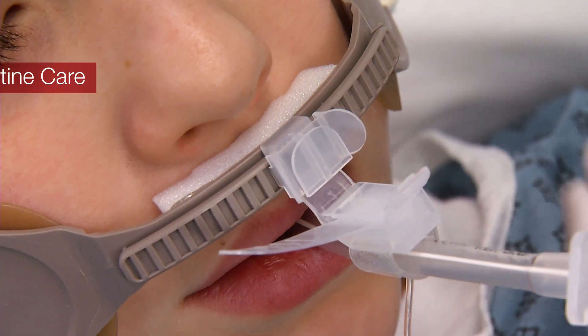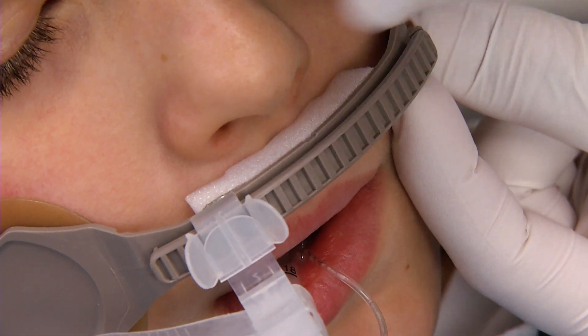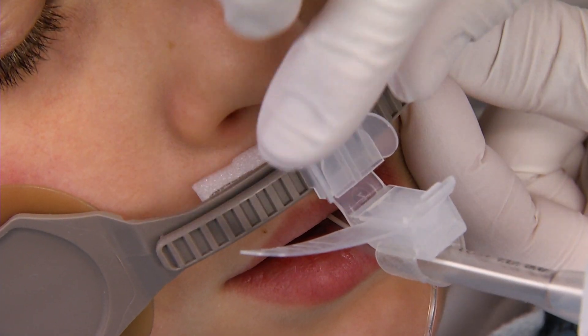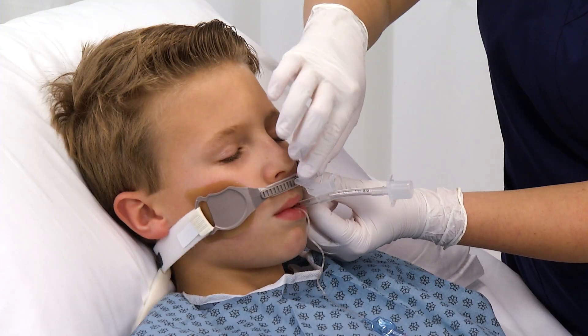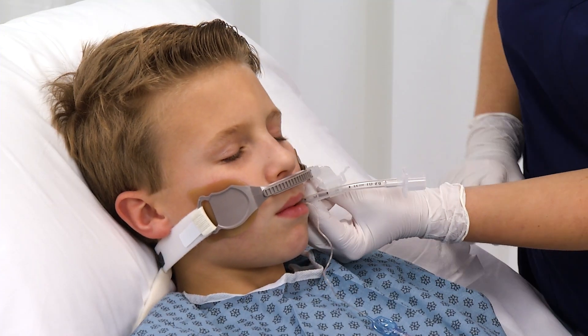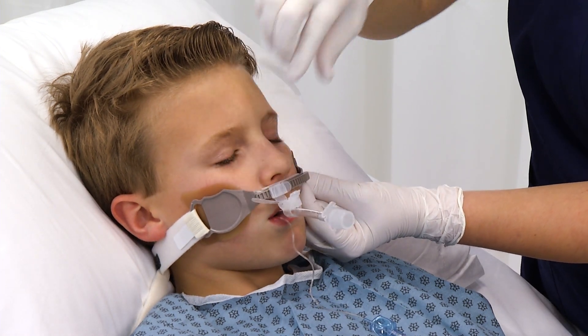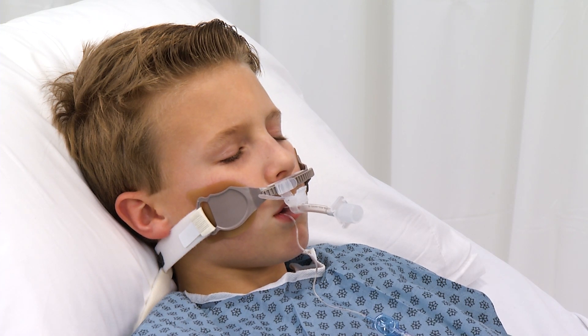To reposition the ET tube, squeeze the gliding tube shuttle tabs on the outer edges and move in either direction along the track. Reposition the ET tube from side to side at least every two hours or more frequently if the patient's condition dictates, to minimize the risk of injury to the skin and/or lips from unrelieved pressure and shear forces.